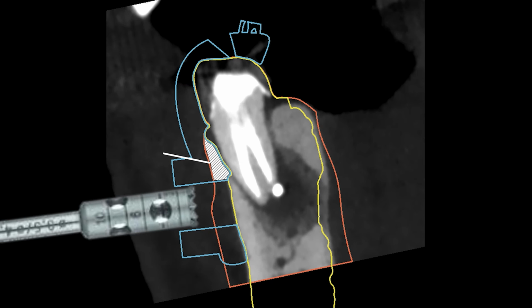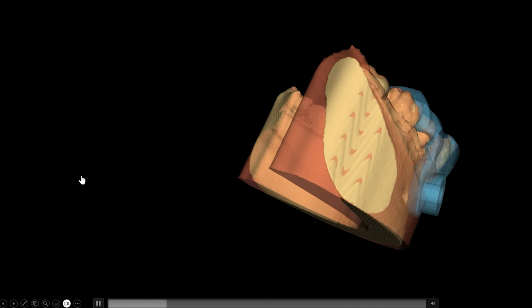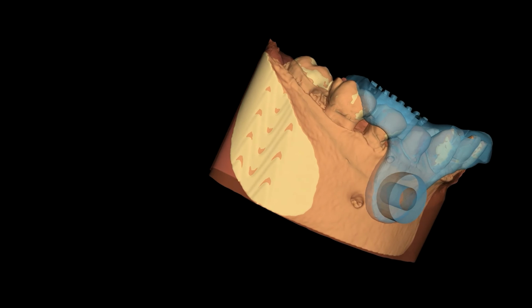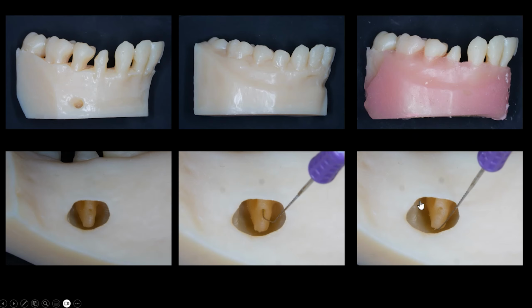Because I work at the hospital, I used this case to manufacture this 3D print model here, and I try to teach our residents with it. I printed it out with the actual canal at the apical part.